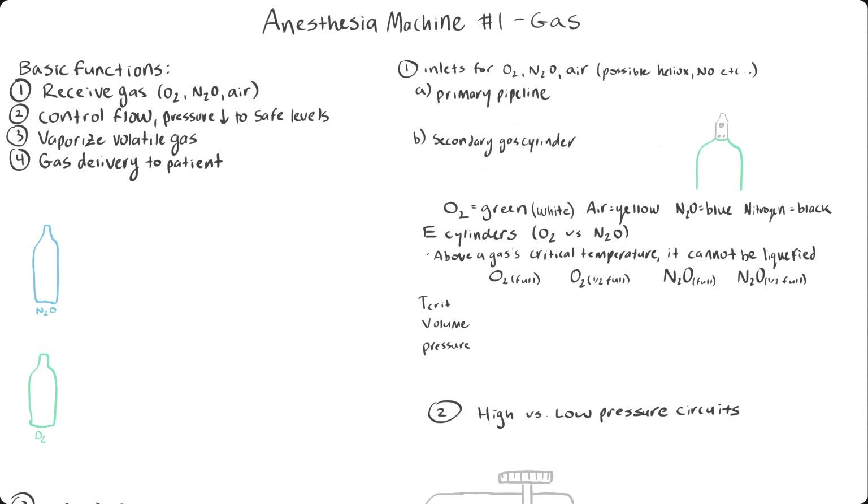Okay, I want to talk to you about the anesthesia machines, also known as anesthesia workstations. I think it's valuable to know a little bit about how these machines function because that should make you feel more comfortable interacting with this relatively complicated piece of equipment.